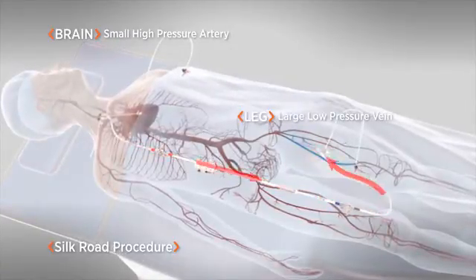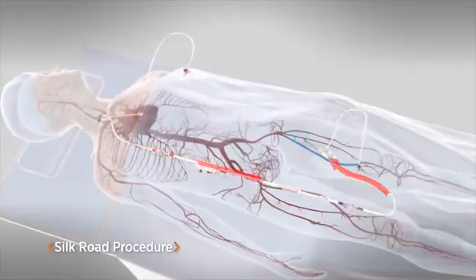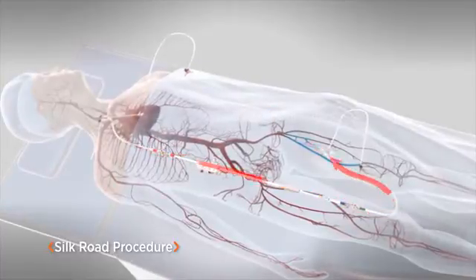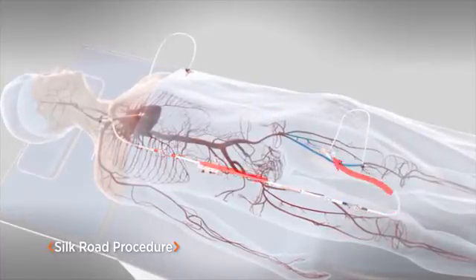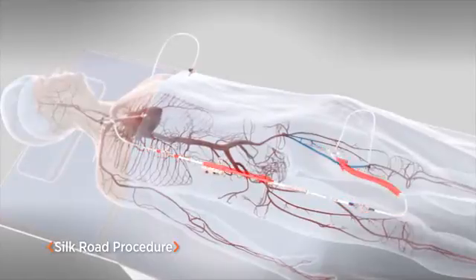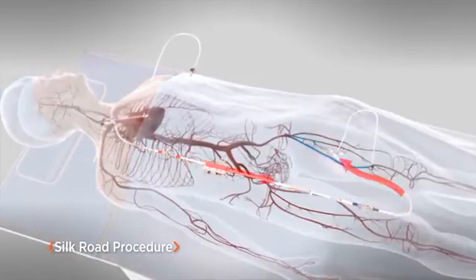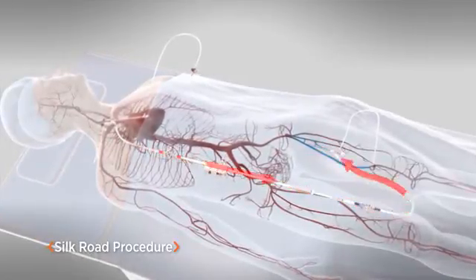Previous studies have shown that this temporary redirection of blood flow is not problematic, because the brain is fed by multiple arteries which maintain cerebral blood flow throughout the procedure.